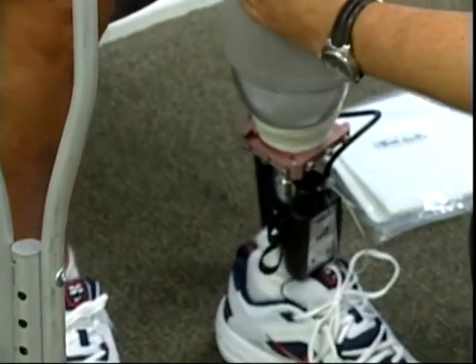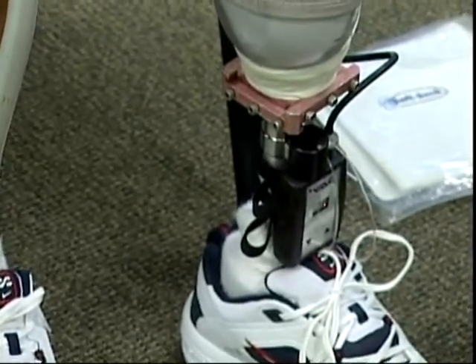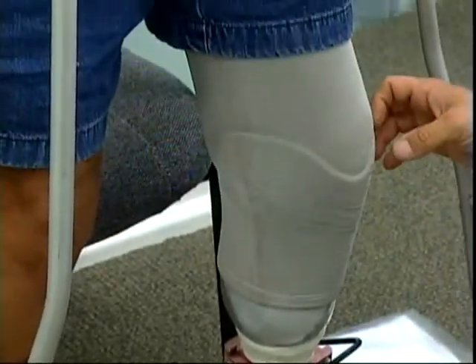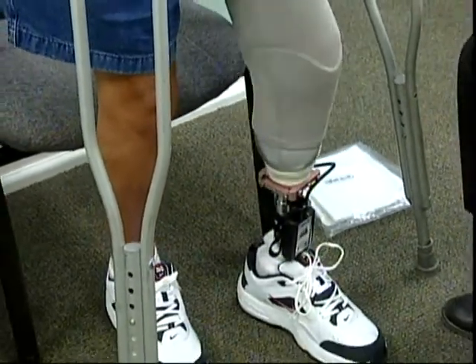You feel like a little air bubble. And now we've attained vacuum. As you can see, the sleeve is sealed in around the top of the socket. The prosthesis is now very intimately attached to him. It's not going to move. I don't have any more displacement.